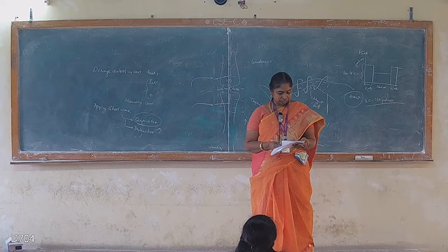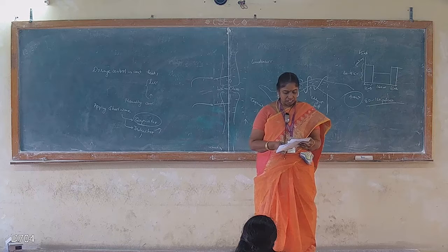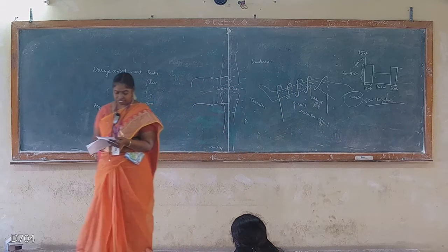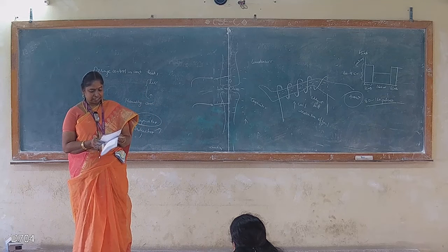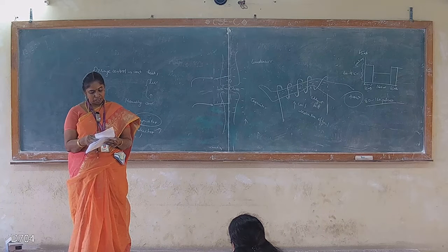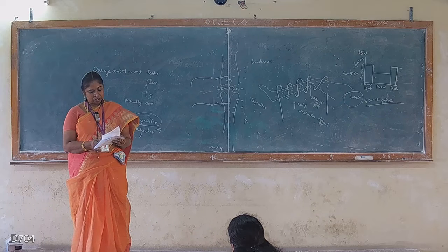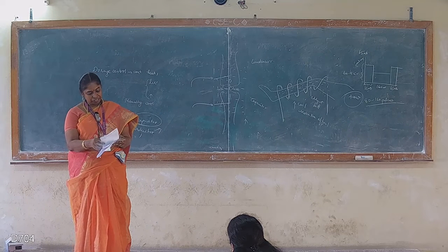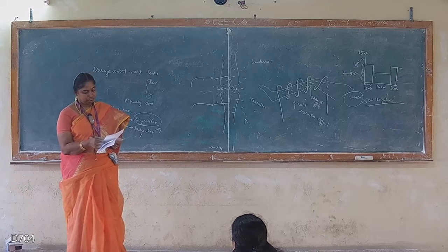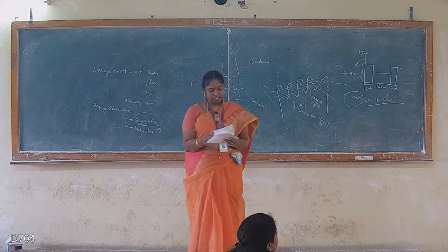7. In the induction field diathermy, the heating effects are done by using dash. Next, true or false. In the true or false, number 1, the smaller the electrode, the more superficial and localized the pattern of heating.